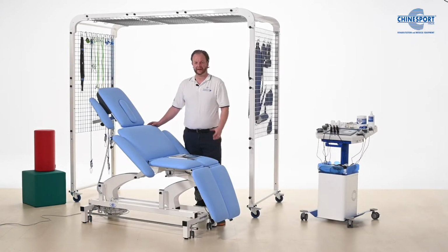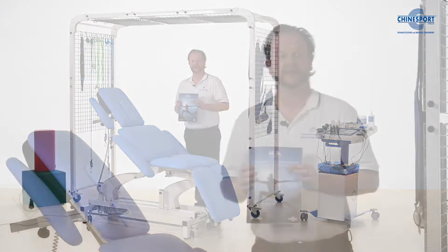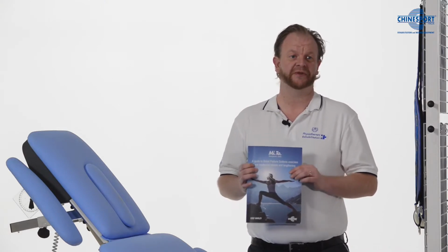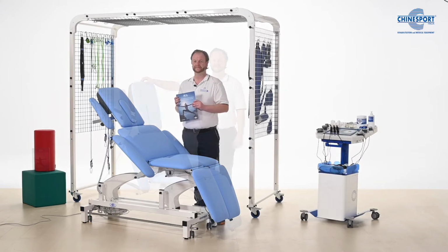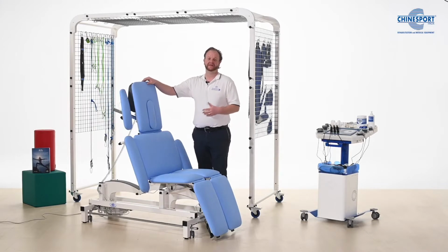in our practice. To keep it short, we're just going to demonstrate a few of the sequences that we would do with somebody with back pain. And if you would like to learn more about the actual sequences and the pathologies we can use the Mi.TO synthesis table with, we've compiled everything into a nice overview in a book which you can consult for more detailed information.